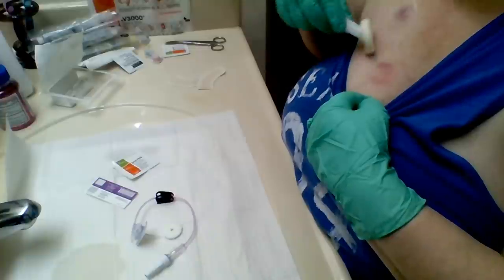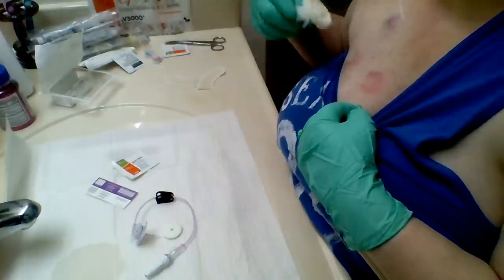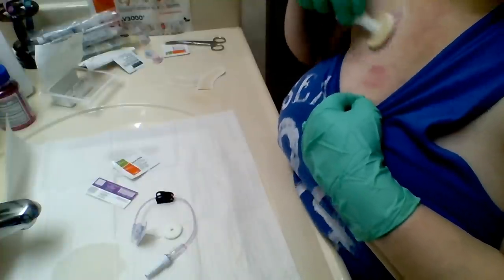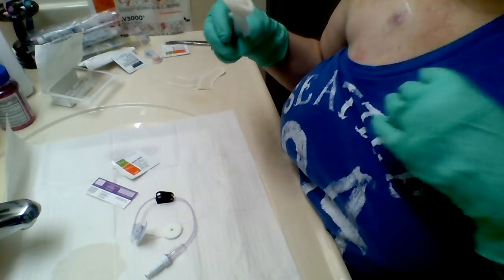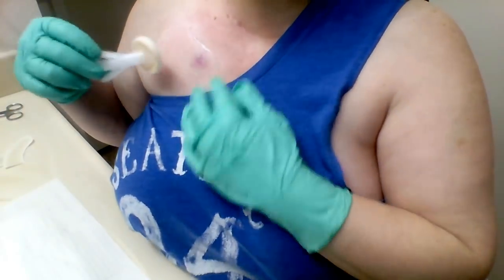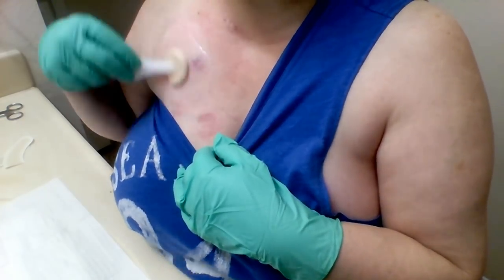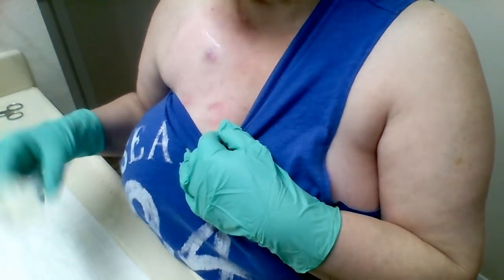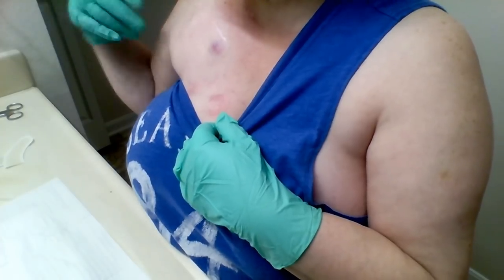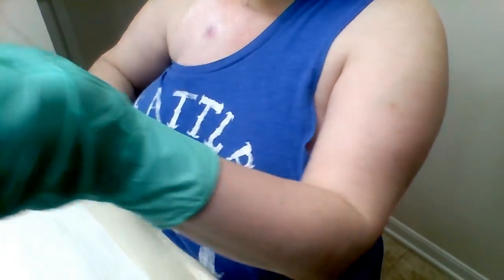There's just a lot of stuff my body can't use anymore, and I have a lot of allergies. You just keep going and going and doing what you've got to do. I don't know why, but I have to have my glasses on when I do this. While we let this sit and dry, I'm opening up a flush.